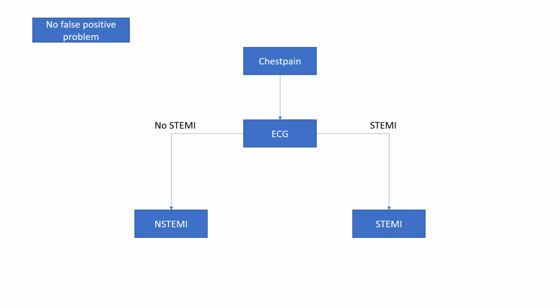And we should not think of this as a diagnostic entity. We should think of it as quite specific, with a high likelihood ratio of there being an OMI. But things that do not live up to the STEMI criteria, the ones we call non-STEMI but are OMI, plus they have at least as high a troponin leak, according to Dr. Smith's studies on this.